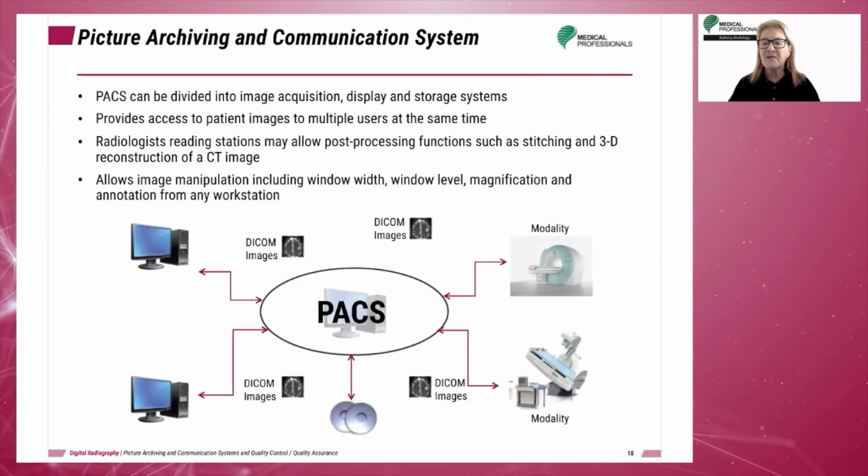The PACS has become an essential part of every radiology department. The system can be divided into image acquisition, image display, and image storage and retrieval.